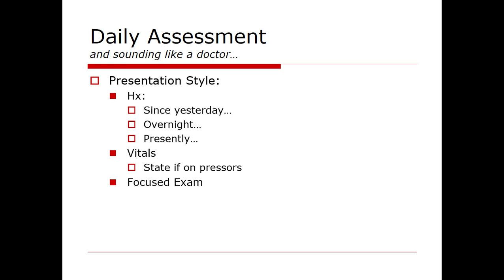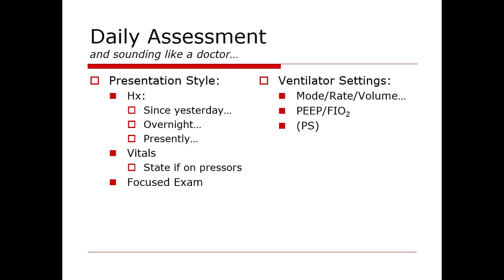Vitals, and I think a significant shortcoming sometimes is people say the blood pressure is stable without mentioning that they're on 4 pressors. Okay, so that's important to comment upon. A very focused exam, and then we head to the ventilator. So you ought to give the mode, and if it's a control, the mode, rate, and volume together, and then the PEEP and the FiO2.